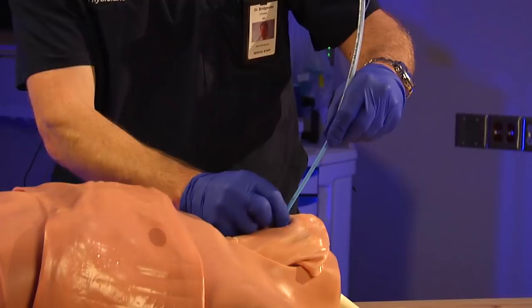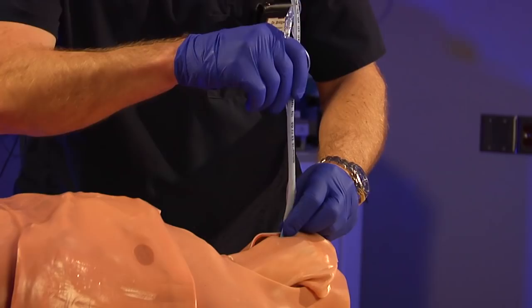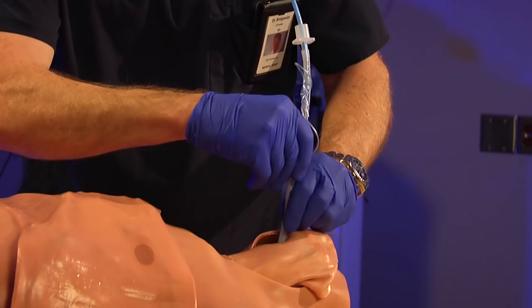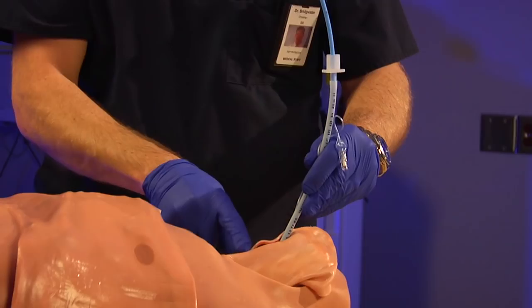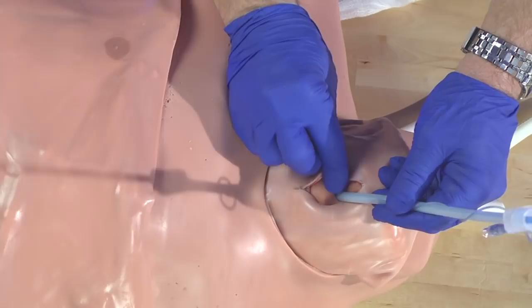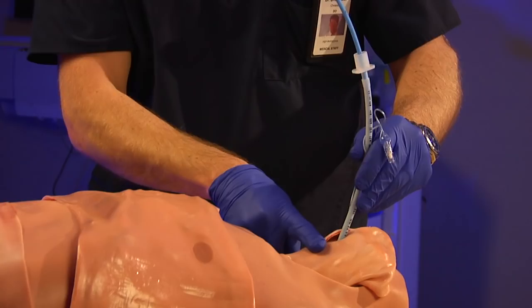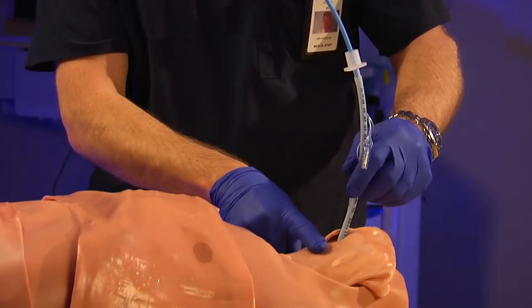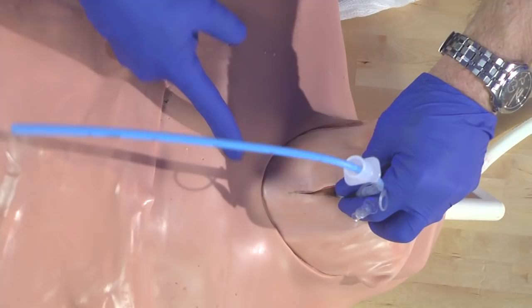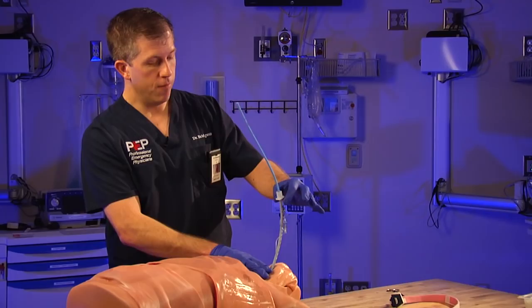I know my bougie has entered right next to the scalpel, so I carefully place the scalpel down and extend the bougie down as far as I can go. The bougie typically goes down into the right main stem following the anatomy. Once extended, very quickly insert the endotracheal tube over the bougie. You're watching the balloon — you don't want to bury this tube. Watch the balloon disappear through the membrane, extend maybe a centimeter more, and that balloon is now sitting in the patient's trachea.